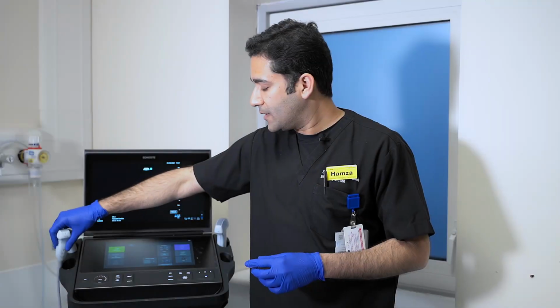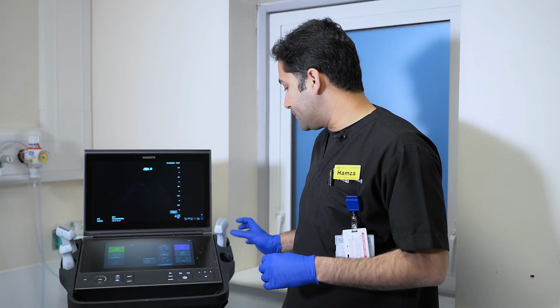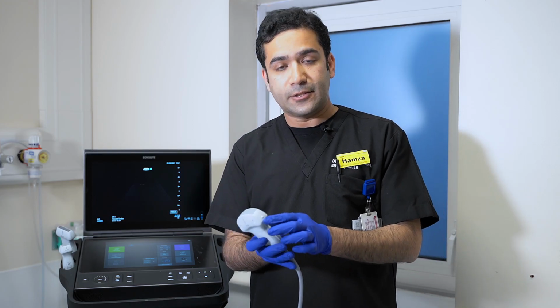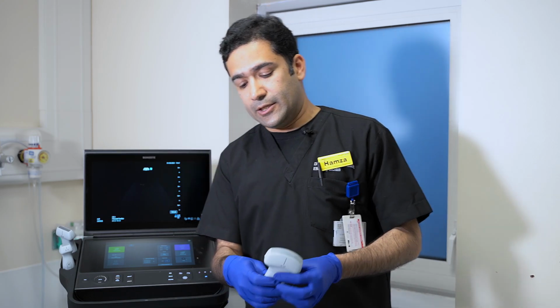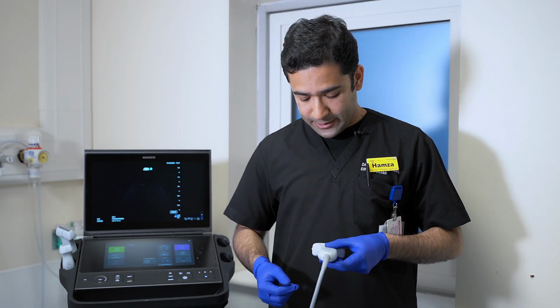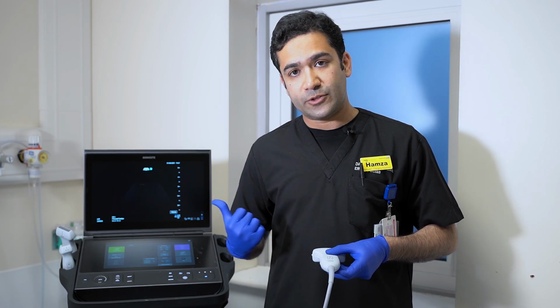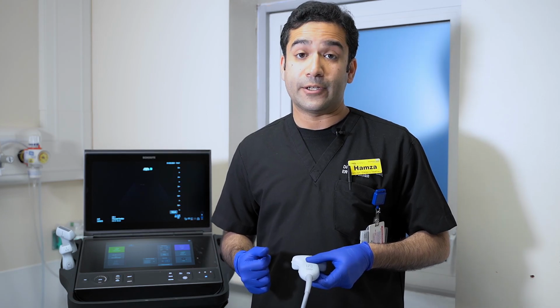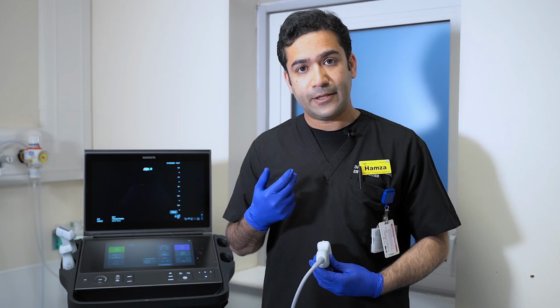screen. And moving on to scanning the aorta, the probe of choice is the curvilinear probe, and this is the probe marker. And just a bit of intro on that, you are going to be placing the patient in, if you're doing a transverse, the probe marker is going to be pointing towards the patient's right. If you are doing it in longitudinal, then it has to be oriented towards the patient's head.